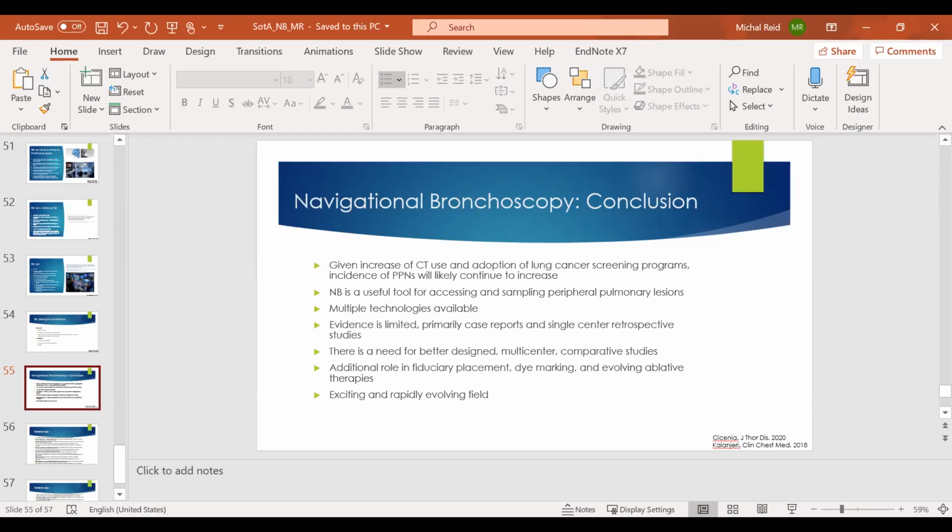If you're behind a rib, which we often see, which I do not fault the radiologist for, or if your access point requires you to cross the fissure between the upper and lower lobe pleura, they'll often refuse because of risk of pneumothorax, which I also don't fault them for. But they're also not the most aggressive because they have other interests. So you have to know your local practice to know if that's really viable. When it comes to staging, you also have to know your surgeon. Some surgeons will say, I want the mediastinum cleared no matter what, and some of that will be based on lesion size. With a 2.5 to 3 centimeter lesion, they'll still want the mediastinum cleared. So you may take that as an opportunity to clear the mediastinum and then try to biopsy the lesion while you're there anyway.